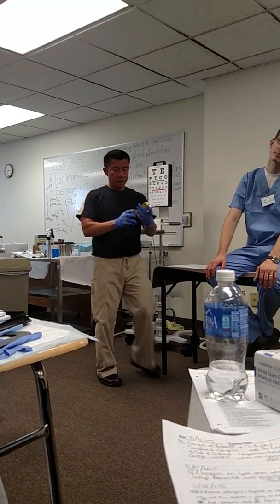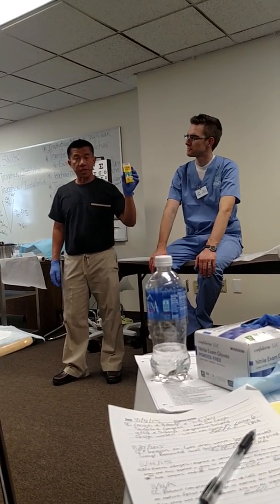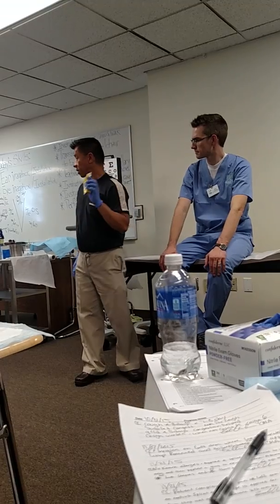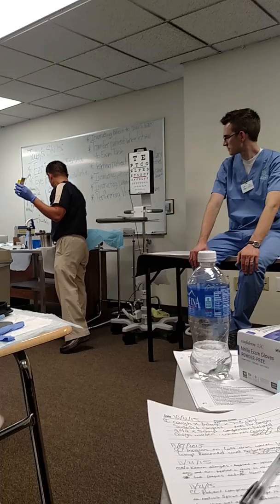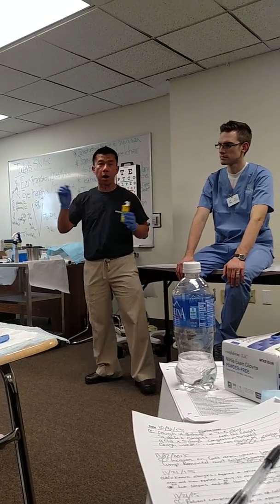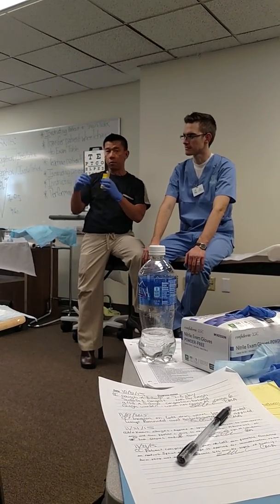Always check first of all the doctor's order, which is earwax aid. Look for the expiration date. You have to check the expiration date. Compare the medication. You want to make sure it's the correct medication, correct patient, and correct dose. The doctor said to instill at least 2 drops. Now, if you're instilling medication, you need some cotton balls. Also, a moistened cotton ball, so that after instillation of the medication it will not, if it is dry, suck off the meds. Are you with me? So you want to have it a little bit moist.